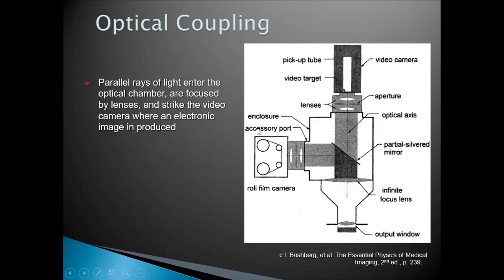This is the film. This is for the manual one, or rather the old one, in which we stop the video acquisition. The two can be acquired at the same time. But because if you're acquiring the two at the same time, the radiologist is not concentrating on the video part but wants to concentrate on the film, this one can be stopped to concentrate on this. Just get the image here, then look at it in detail.